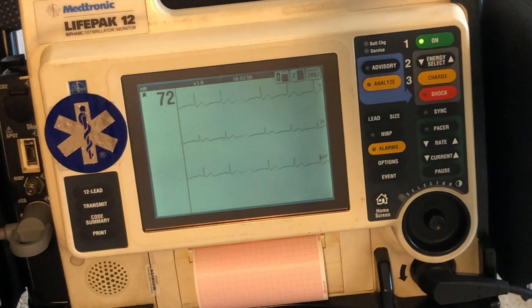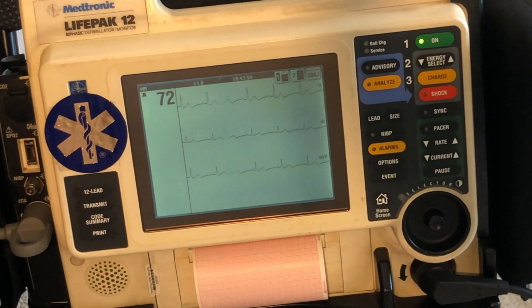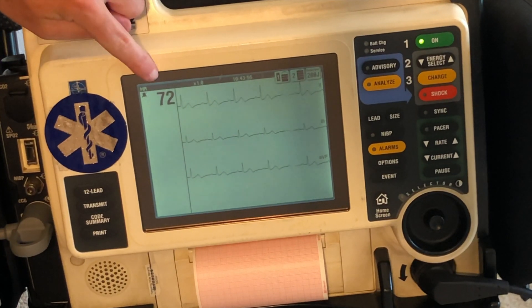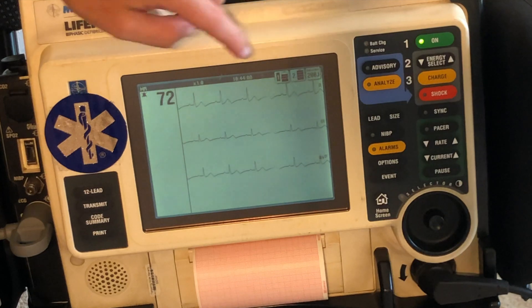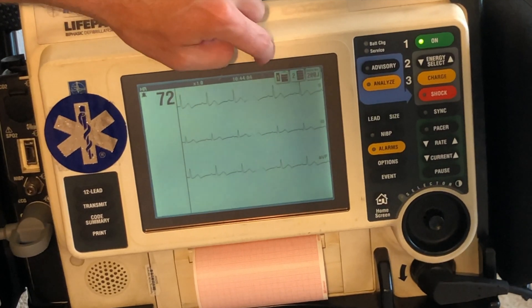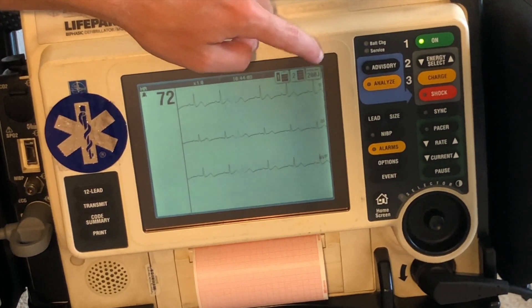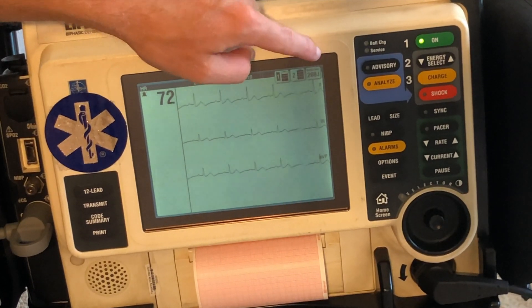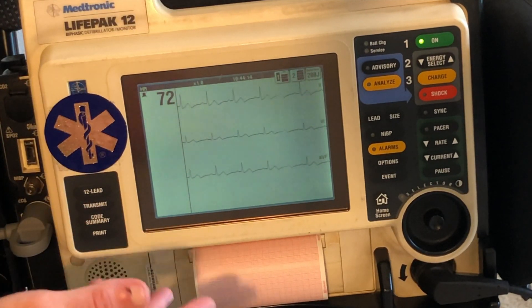I've zoomed in here so you can get a good picture of what we're doing with the monitor. You can see here we have the heart rate of 72, normal sinus rhythm, this is lead two. We have the time and the battery charge. And then we also have what the monitor charge is set to — doesn't mean we're doing anything yet. I'll show you how to do that later — just what the settings are showing.